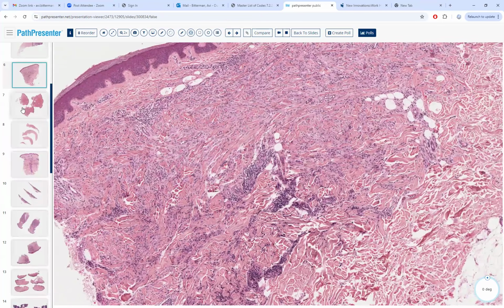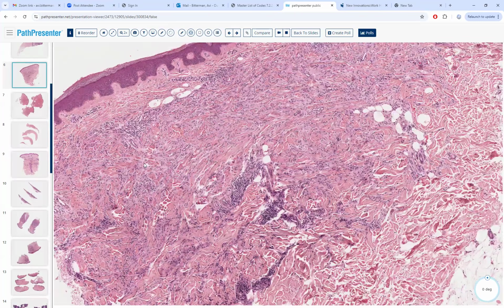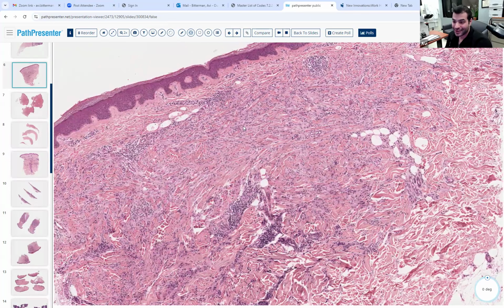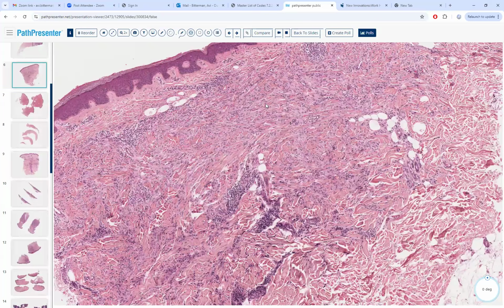No, but isn't the definition of a granuloma histiocytes coming together around something? You can have granulomas that are palisading around something, walling something off, and you can have granulomatous inflammation like this. This is a granulomatous infiltrate because they're just histiocytes, but they're not forming a palisaded granuloma. So something can be a granuloma without coalescing around something.